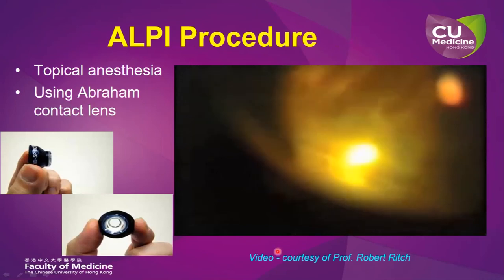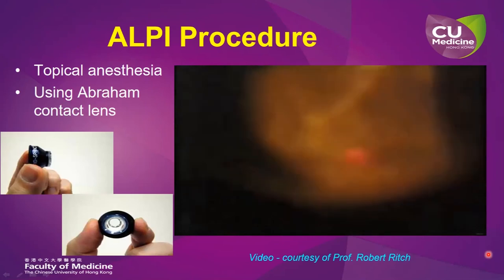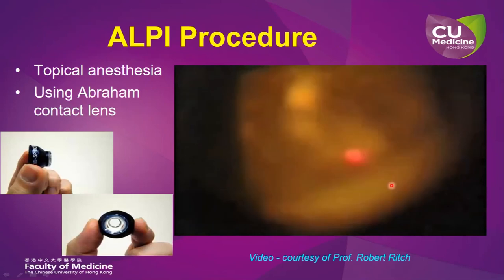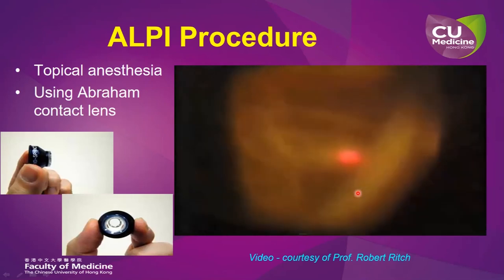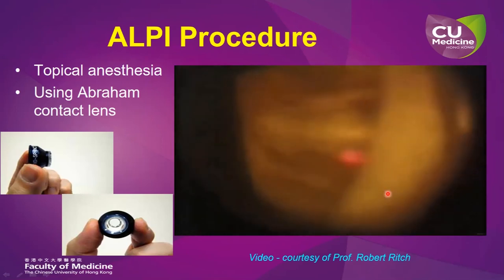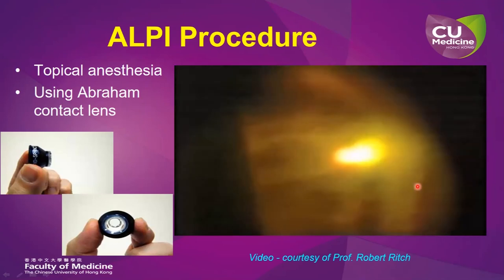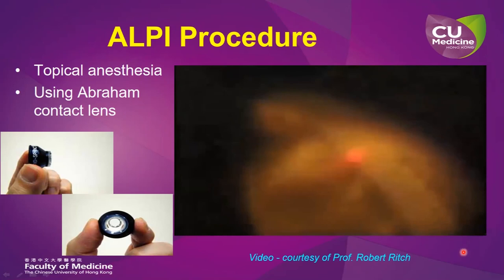Now, this is a video showing the application of ALPI in an eye with plateau iris syndrome. You can see that there is immediate iris contraction around the spot of laser application, which on the one hand thins the iris stroma and also pulls the iris away from the drainage angle, thereby reopening the positionally closed drainage angle. I normally perform this under topical anesthesia, and personally I prefer the use of the Abraham contact lens.